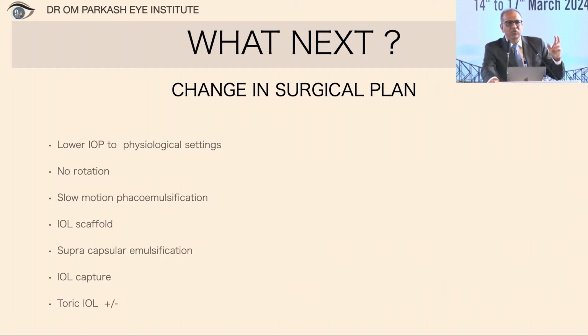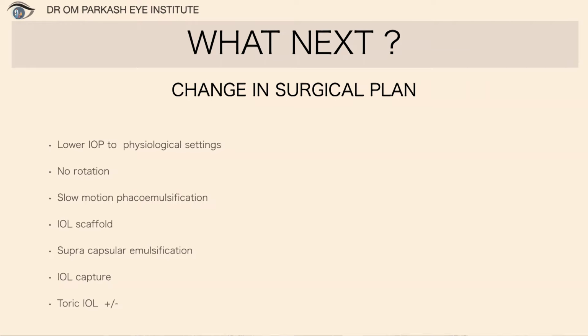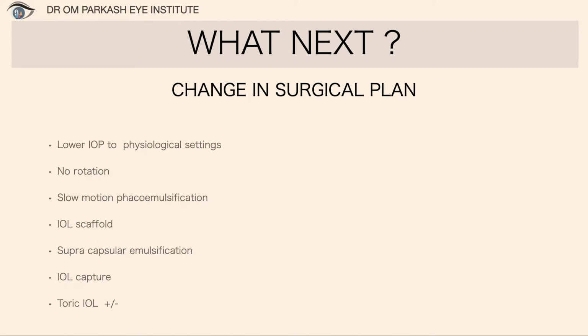So now what is the change in surgical plan? Just wanted to add in fibrotic cataract that by increasing the laser energy in femto and the incision depth, we can do a very good rexes in femto, because it cuts the capsule over the fibrotic bands. So capsule rexes is very good in fibrotic cataract in femto. Absolutely correct.